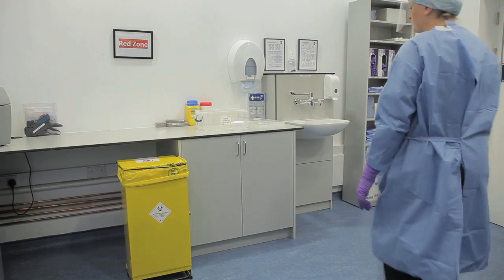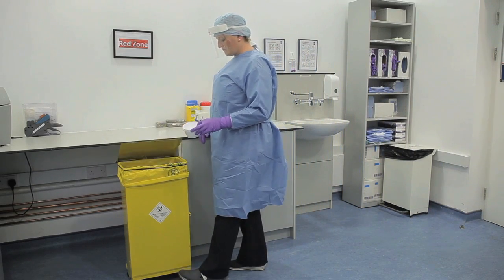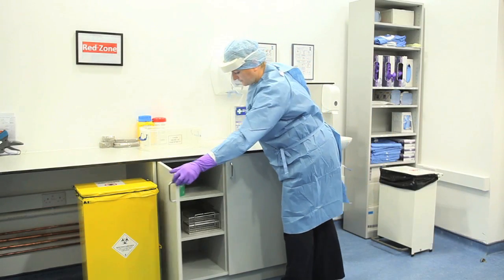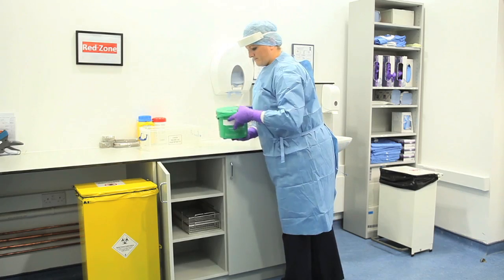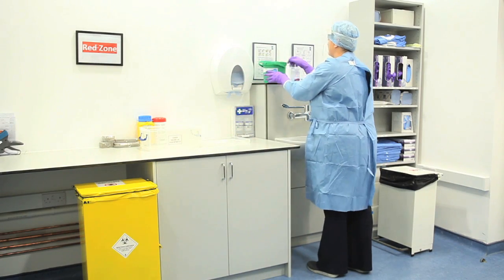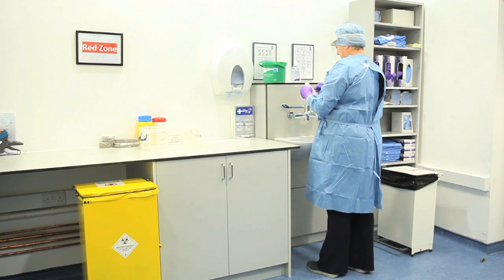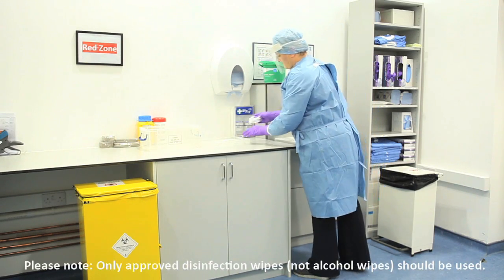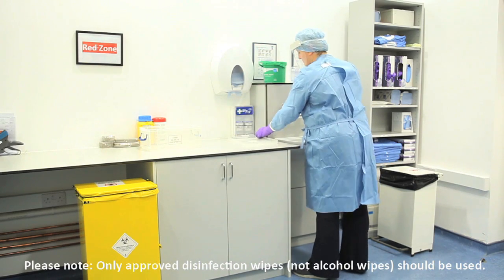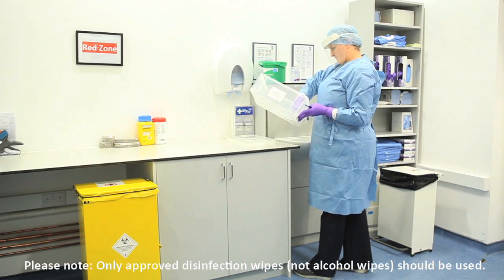The dental healthcare worker removes their gloves and disposes of them into the appropriate foot-operated healthcare risk waste bin. The dental healthcare worker carries out hand hygiene, dons a new pair of gloves and performs surface cleaning. All areas which have been in contact with a contaminated RIMD must be cleaned and decontaminated. Suitable wipes for decontamination of hard surfaces must comply with appropriate European standards.